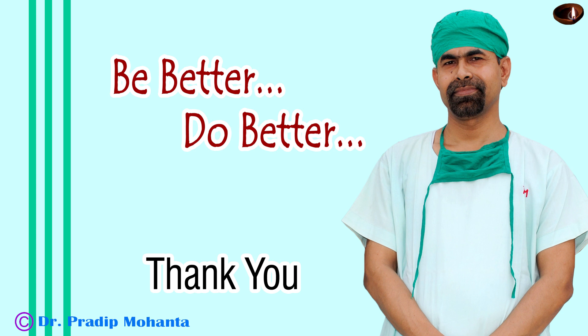Thank you very much for your attention. Always remember, you have to hold the nucleus very firmly before you attempt direct chop. If the cataract is of medium density, hold it at the center. If it is harder, cross the center and hold it midway between the center and the opposite equator, then try chopping — try submarine chop; it's a very good technique. Be a great surgeon, and serve your patients with love, respect, empathy, and great surgical competence.